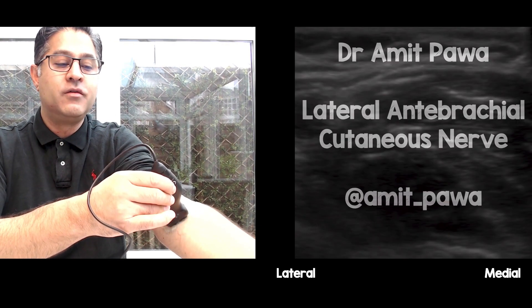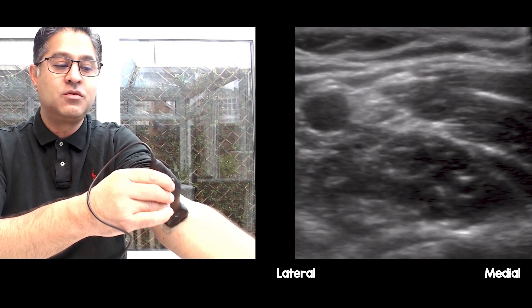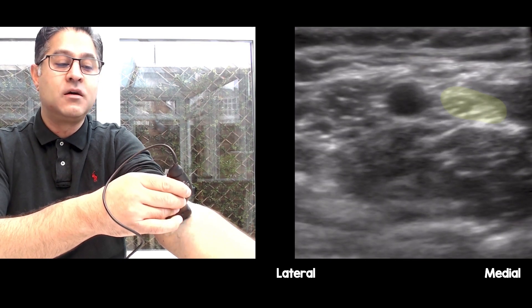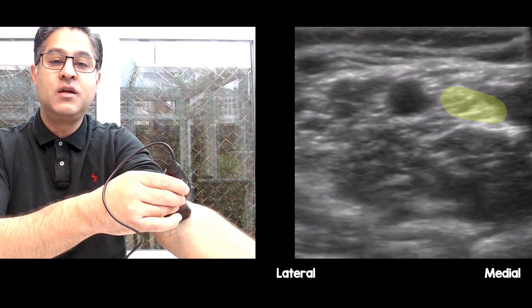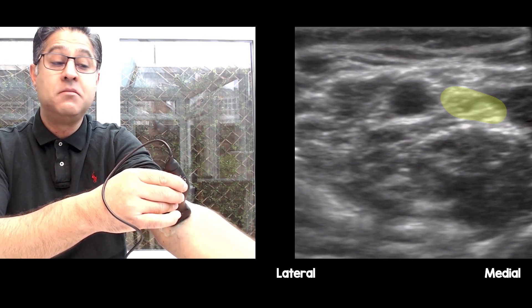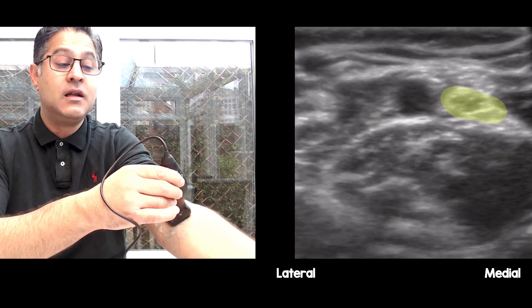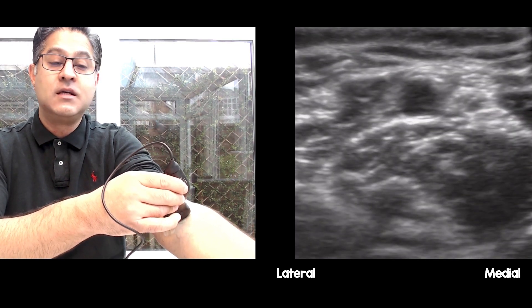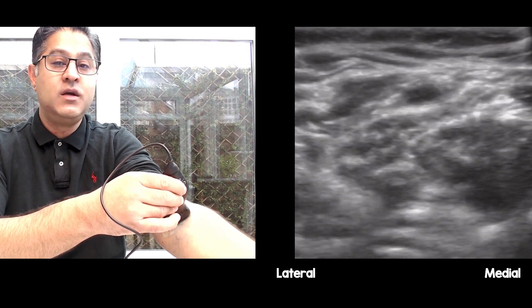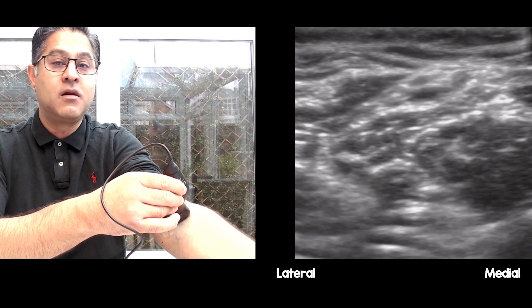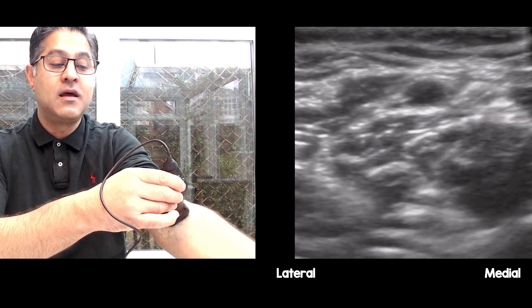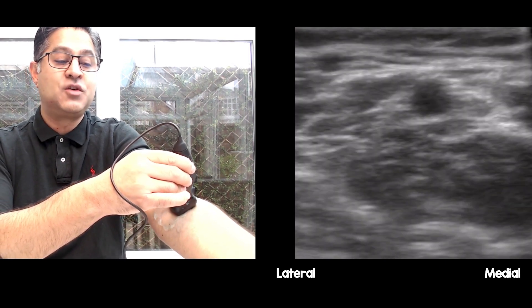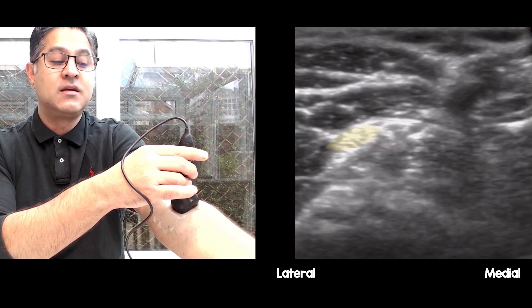I'm going to place it medial over my antecubital fossa. When I do that and place the brachial artery in the center of the screen, you can hopefully see the median nerve lying on the medial side of it — so brachial artery, median nerve — and if I squeeze, you'll see the brachial artery pulsating.